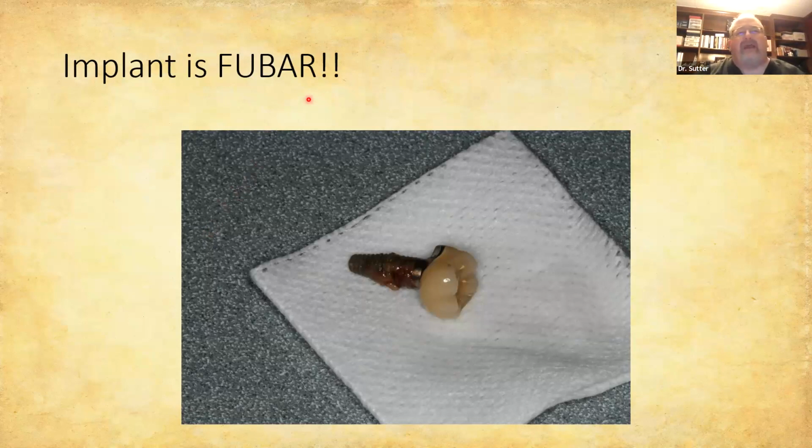Every single implant that you restore, you need to verify it's not overloaded with a T-scan. You got to have it. There's no debate. You have to have it. You got to make this part of your armamentarium, guys.